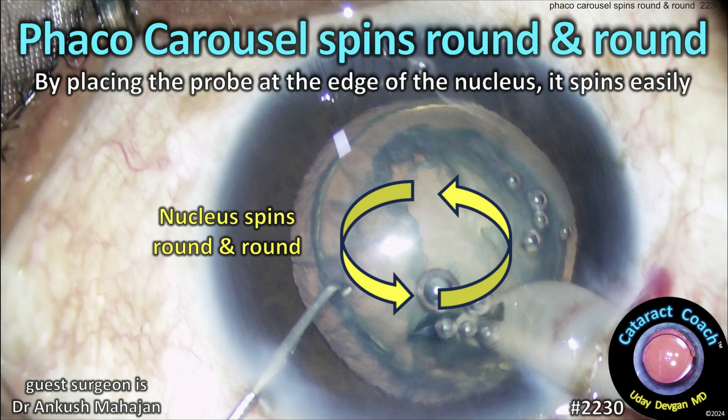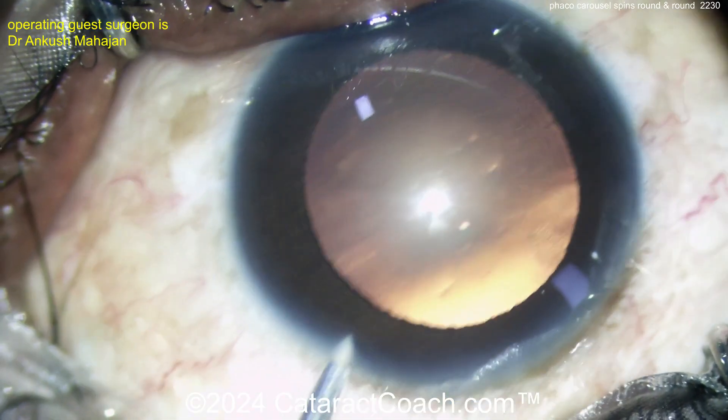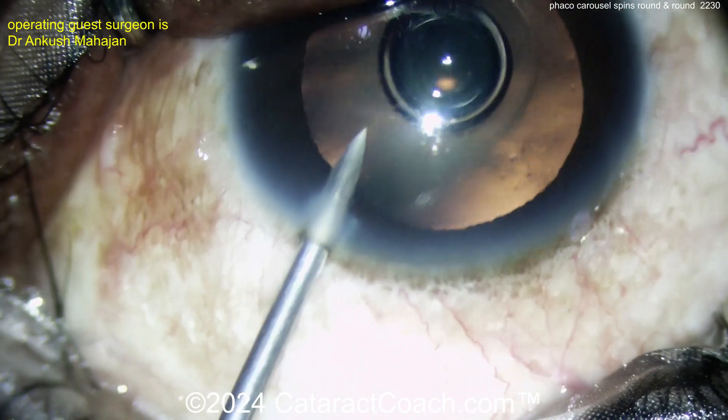CataractCoach.com. The FACO carousel spins round and round. By placing the probe at the edge of the nucleus, it spins easily. Let me show you the case here. So routine cataract case, not too dense.